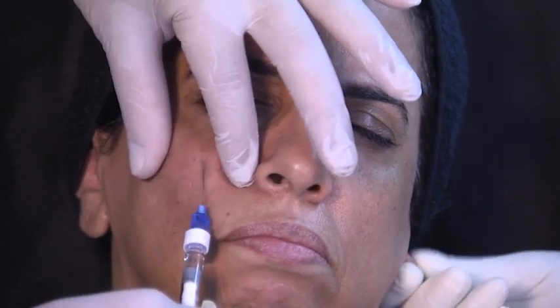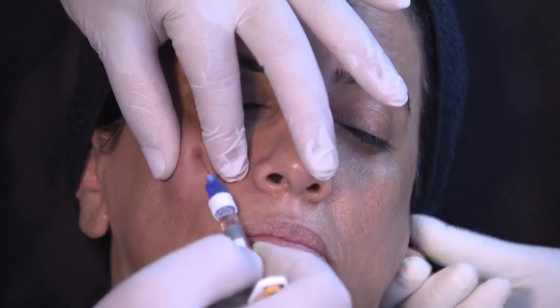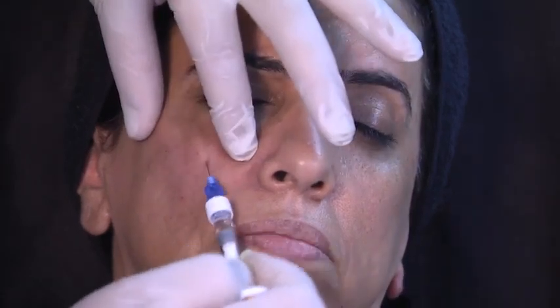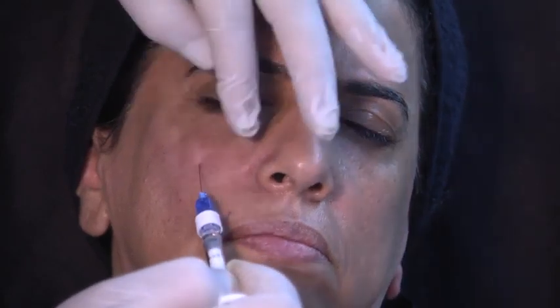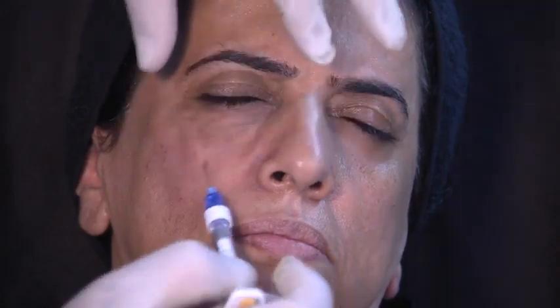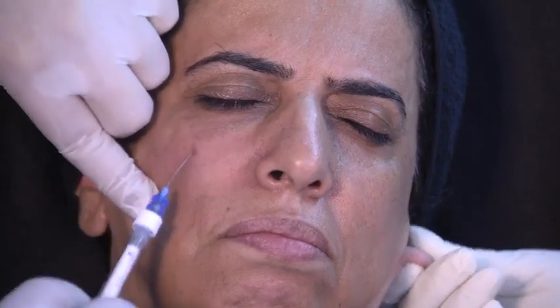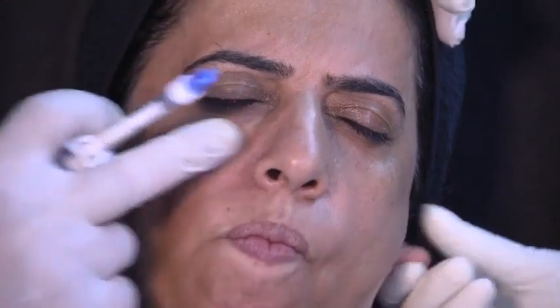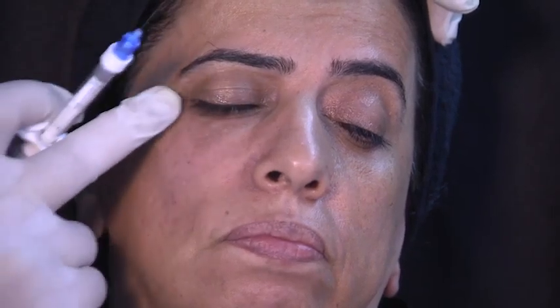Remember, this is still NASHA technology. It has capacity to lift. Do the small deposit. Now I change. When I change, I pinch the skin very slowly, very smoothly. Now I keep pinching the skin when I have to change the direction, because I increase the resistance, and it's easier to go through a firmer resistance. Okay, now I go to this area, and finally lateral.